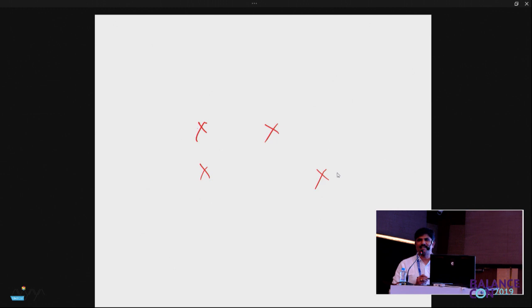Fine? If there is a miscalculation of the initial velocity, instead of going from here to here in one go, if there is an underestimation of how much is there, what will happen? The eye will reach up to here using a fast movement. From there it will resort to another category of slower eye movement to get pulled there. Yes or no? Yes? Okay.